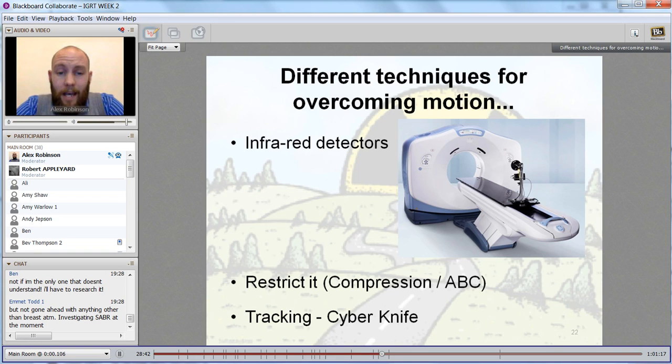The other thing that we can do is restrict it. It tends to be an abdominal compressor. On the abdomen, they usually place a polystyrene object onto it to literally minimize how much the patient can breathe. Okay. The compliance issues are quite high. We have issues whether we're looking at the infrared, the abdominal pressure, or the restrictor. Some patients, it doesn't matter how long you try, you just cannot get the perfect data set. And there's not much we can do about that.